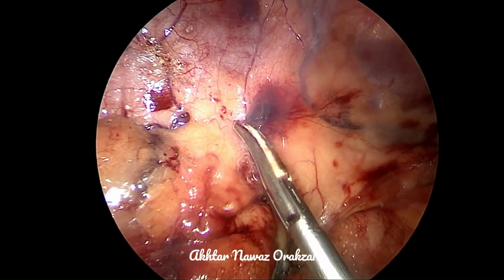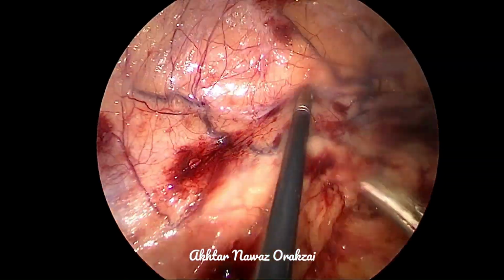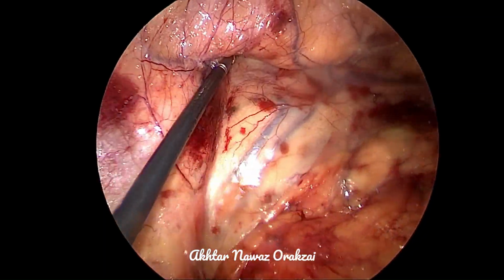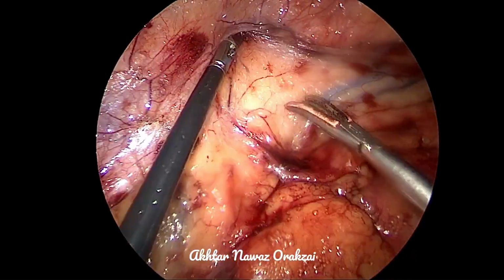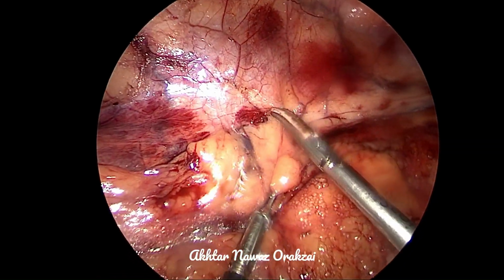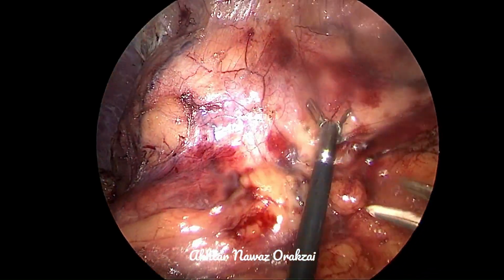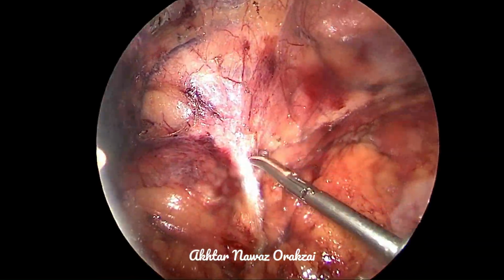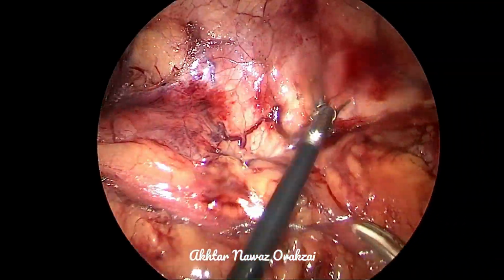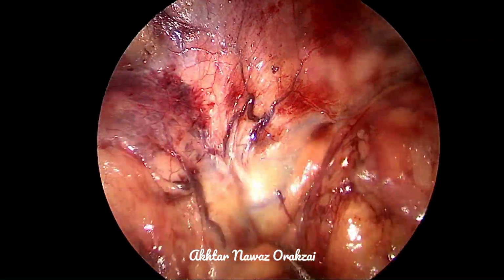And lower down, when we medialize the colon, we identify the ureter and the gonadal vein. Here you can see the gonadal vein very clearly, and the ureter can be seen as well. Remember, this is not a nephrectomy, so care must be taken not to injure the ureter directly or by thermal means, by using the cautery or the bipolar. Ureter is very sensitive to thermal injury, so care must be taken.